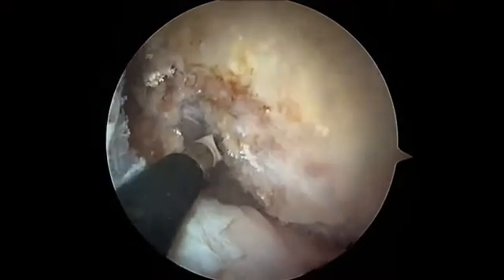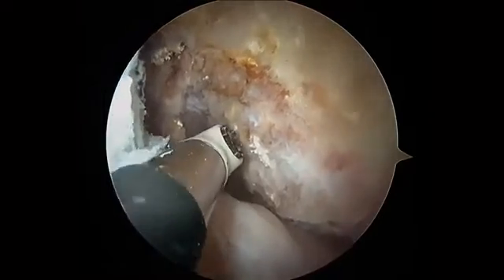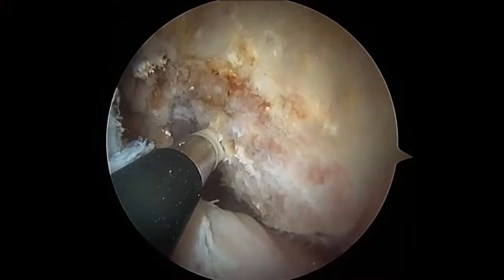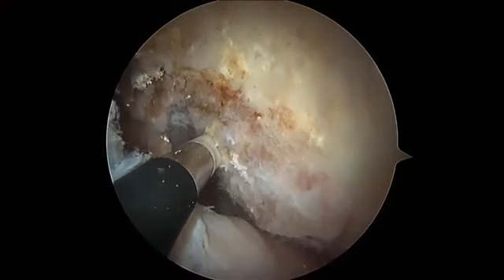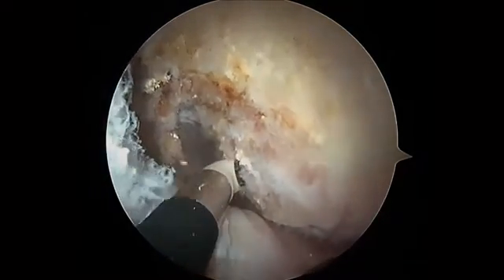So this is deep, shallow, high or anterior, low or posterior. We want to be in the ideal position, somewhere in this region. Our ideal position will be isometric. We feel this is the most isometric region of the footprint. It's in the direct insertion. So these are the direct fibers of the ACL.